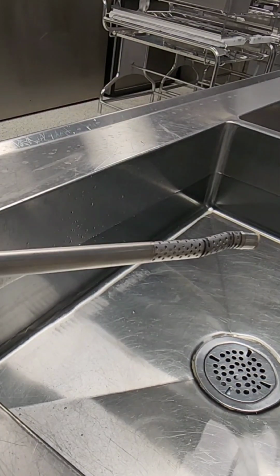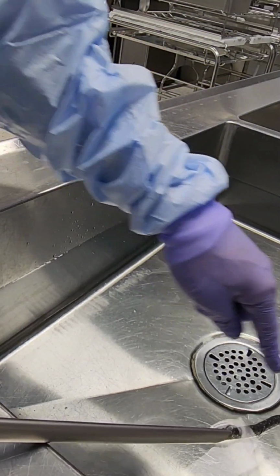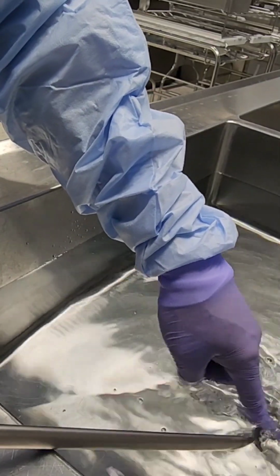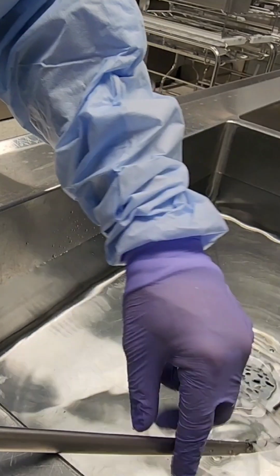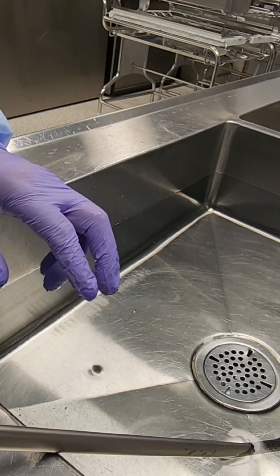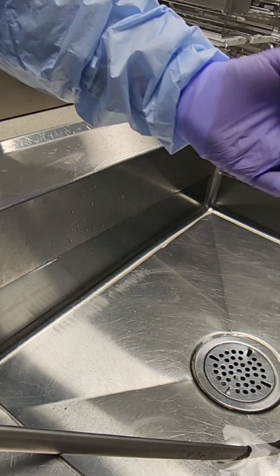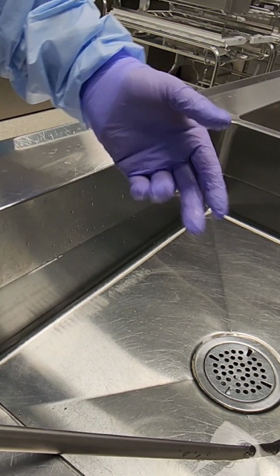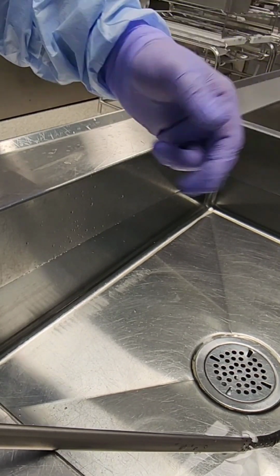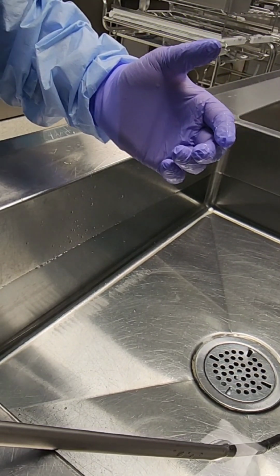Once you get to that pressure, you're going to fill your sink up with cool water, no soap in there, just cool plain water, and you're just going to submerge the distal tip all the way to cover up all the mesh areas or the open areas of that scope. Ensure that all the bubbles are taken off the surface of the instrument by agitating the instrument a little bit, and then 30 seconds, guys. That's singing happy birthday 3 times to yourself. Ensure that that device is submerged.